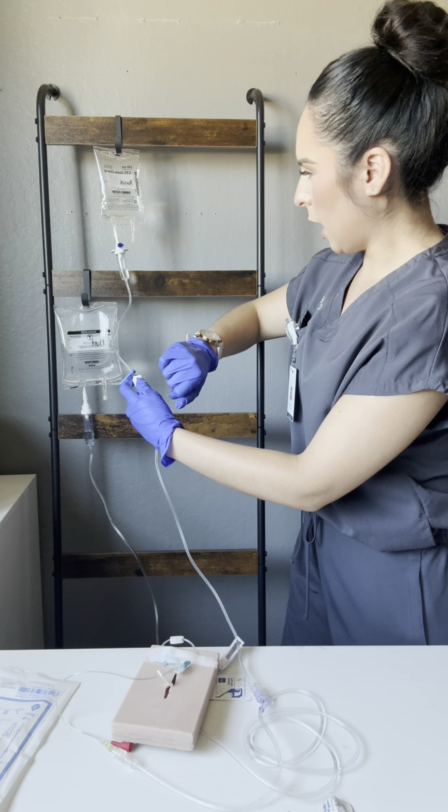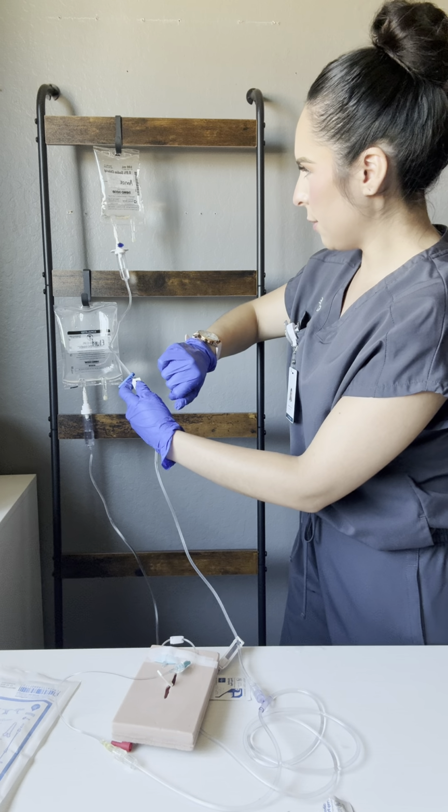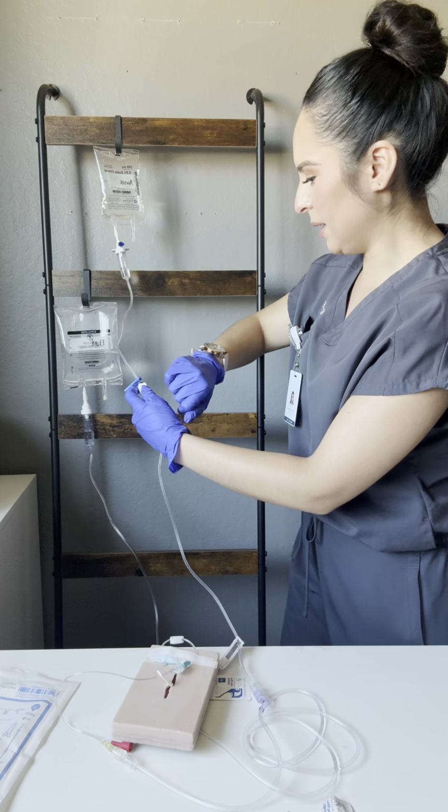Okay, so we are at 100 drops per minute for our piggyback for amoxicillin.